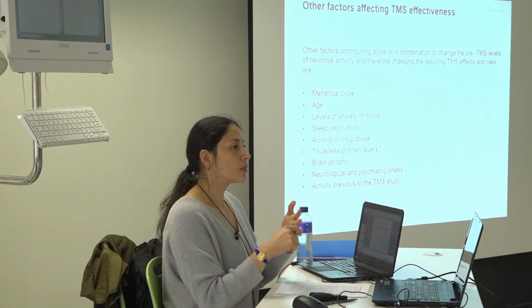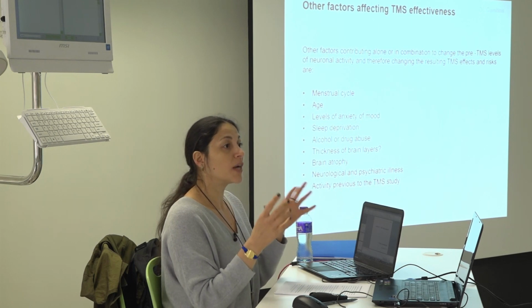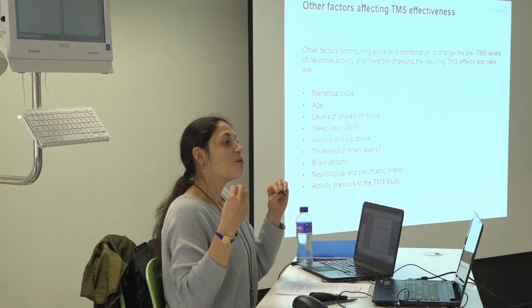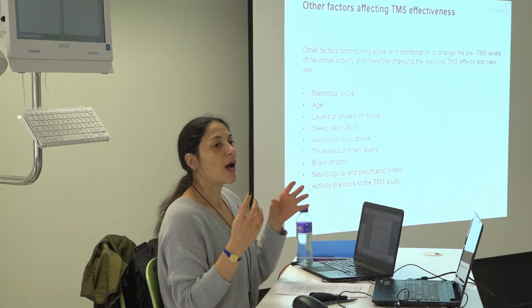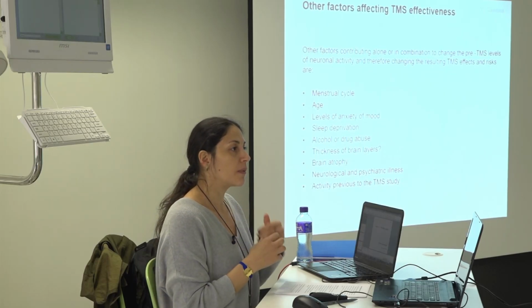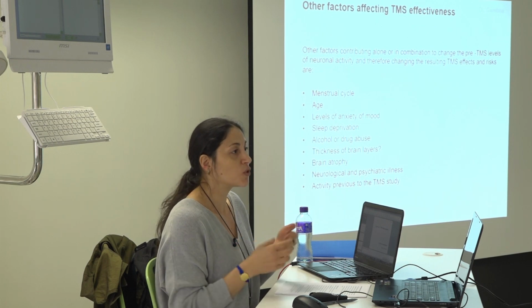Not only that, I think there are some studies if you are working with memory or with certain cognitive processes. There are some studies that show that if the person is during this period, there are some changes in memory. But of course, you have studies showing yes, and you have studies showing no. But for TMS particularly, I wouldn't do it. No, I don't do it. I take this into account, and I write down, when was your last period, to know where the stage of the cycle is. Yeah, it's a recommendation. You can do it as you wish.